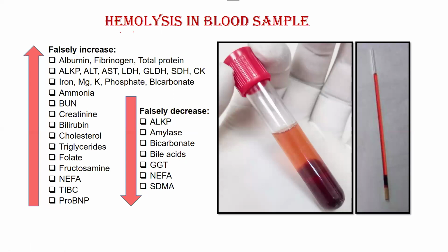So next thing is hemolysis. If you have taken blood from an animal, and inside that animal the blood was in a hemolysis state, or the blood sample got hemolyzed while injecting it into the vacutainer, or it is a storage sample, hemolysis has happened. It doesn't matter the cause of hemolysis, hemolysis is going to affect the blood sample. It is going to falsely increase some tests, and it is going to falsely decrease the concentration or values of other things in the panel test.